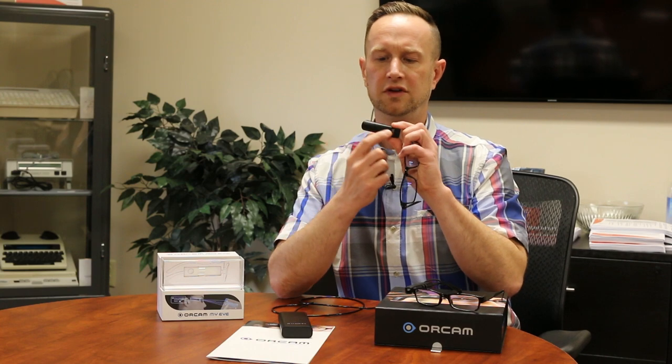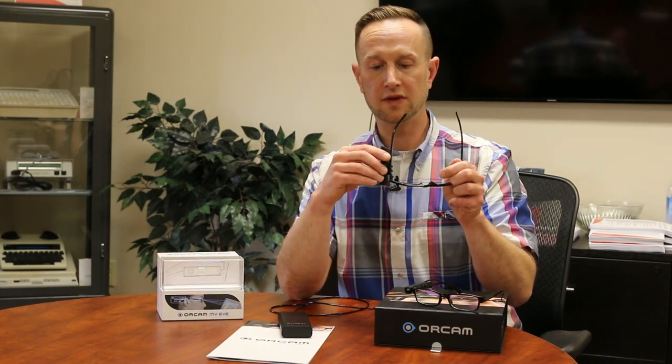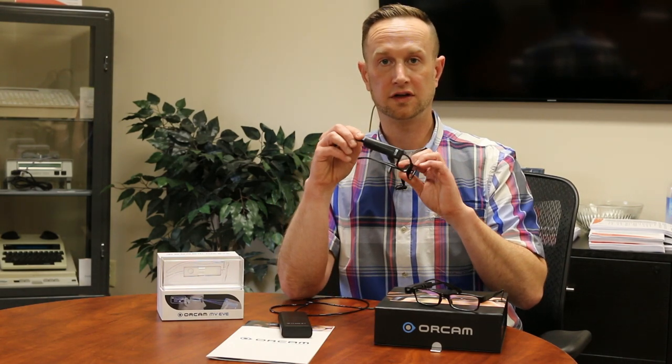The MyEye 2.0 also has a touch bar on the side. If you tap it, it acts like the trigger button and starts reading. Tap it again to pause. You can swipe forward on the bar to fast forward, or swipe back to rewind. All the menu functionality is accessible here as well, and it has all the features of the MyEye in a fully wireless device.